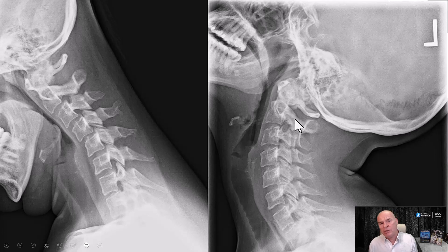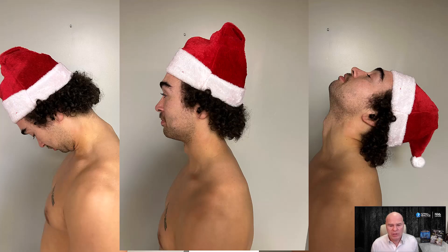I had my son over Christmas time — I think last year — we were looking at some images and I said, 'Hey, let me just put you up against the wall and show you some positions.' So these are the positions. He has a hat on because it was Christmas time. You want to bend the neck forward, have a neutral, and bend the neck backwards.